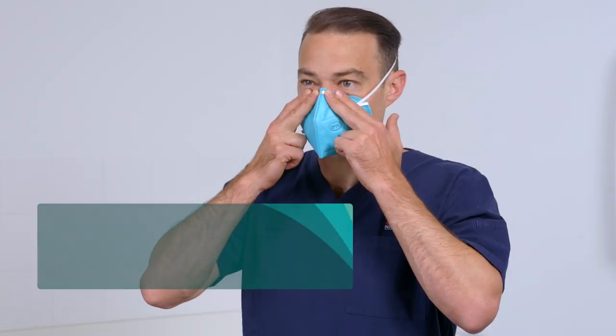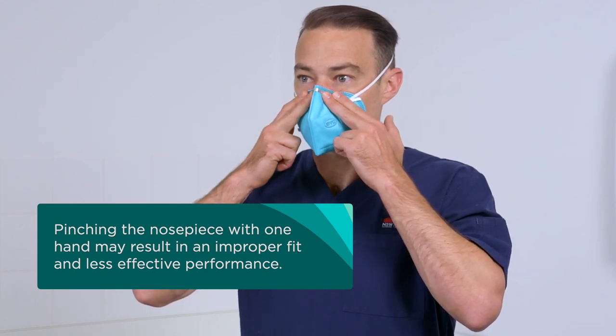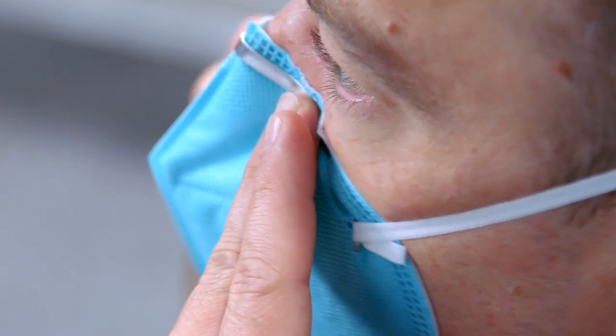Always use two hands when moulding the nosepiece. Pinching with one hand may result in improper fit and less effective respirator performance. Conform the nosepiece across the bridge of your nose by firmly pressing down with your fingers.